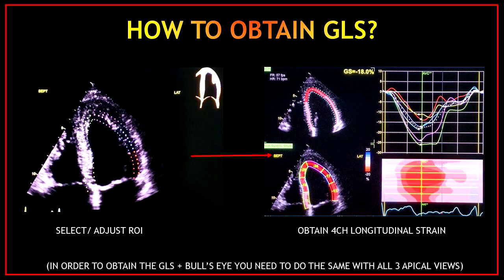One more time, the artificial intelligence will automatically recognize the view and select the region of interest. It's always good practice to check that you have the correct view and that the region of interest is being tracked appropriately. If you are not happy, you can always adjust it manually. Once happy, click the process button. Now we have the four-chamber longitudinal strain — this is the last piece needed to get the global longitudinal strain and the bullseye.